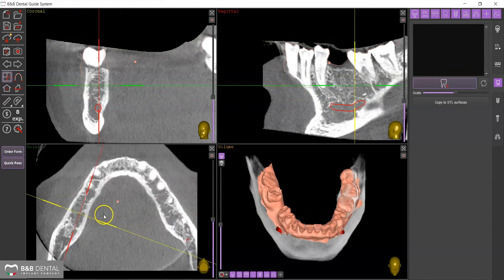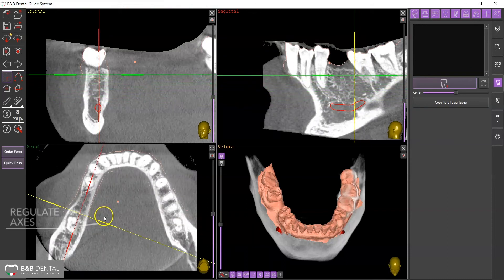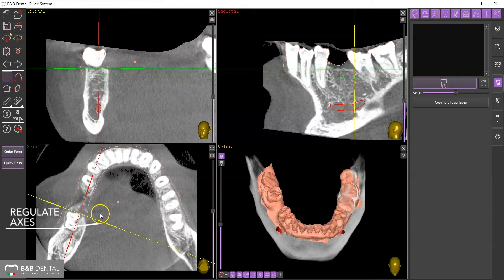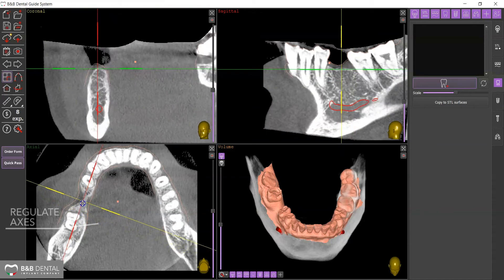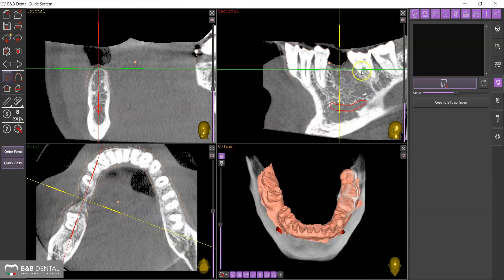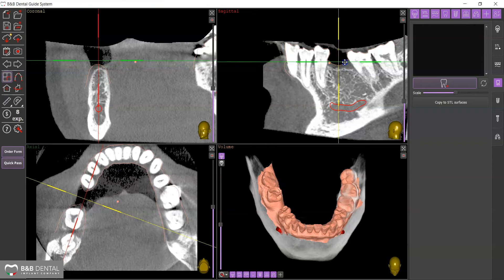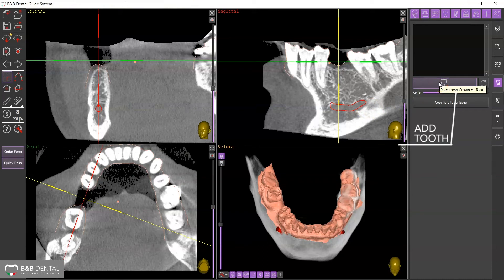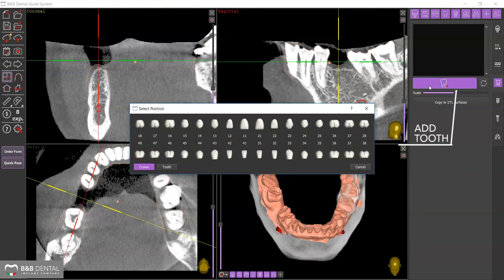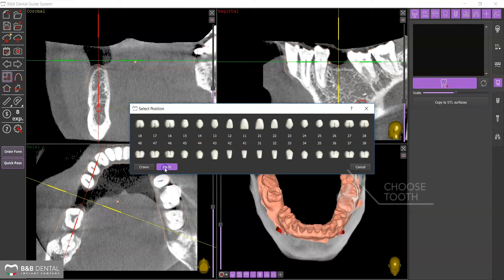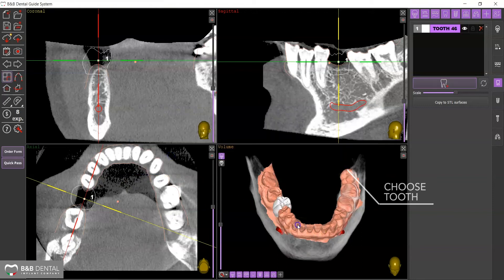Adjust the axes by placing their intersection in the position where you wish to insert a tooth type. Click on the Add Tooth icon and select the position and tooth to insert from the panel. The software will insert the chosen element arbitrarily by roughly adjusting its size.